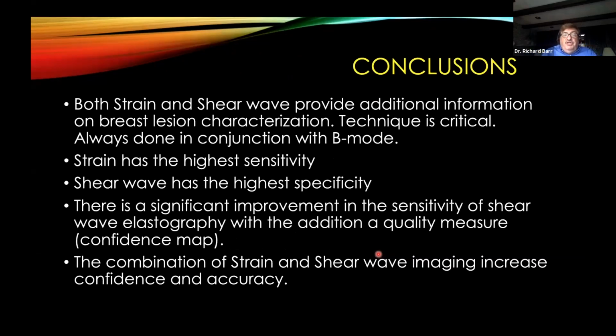So both strain and shear wave provide additional information on breast lesion characterization. Technique is critical, always done in conjunction with B mode. I didn't mention BI-RADS a lot, but obviously in those higher BI-RADS of 4C and a 5, we would probably always biopsy the lesion.